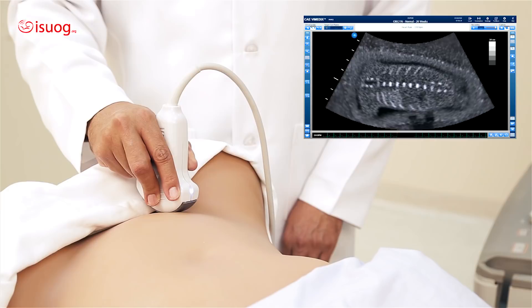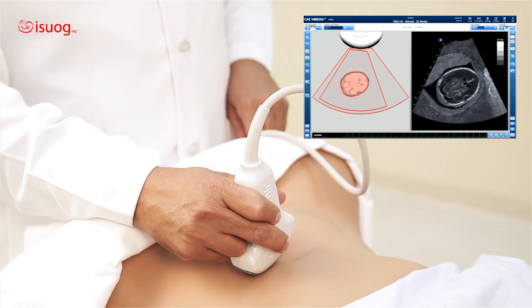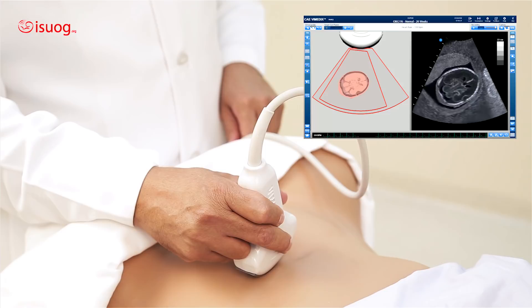Now I would like to show you how to combine movements. I have used an interactive diagram on the left of the screen, and on the right side is the ultrasound screen. I am looking at the biparietal diameter — I want to correct it as it is a little oblique. To correct it horizontally, I need to dip. And as we said, dipping is always followed by sliding on the narrow, to bring it to the center.